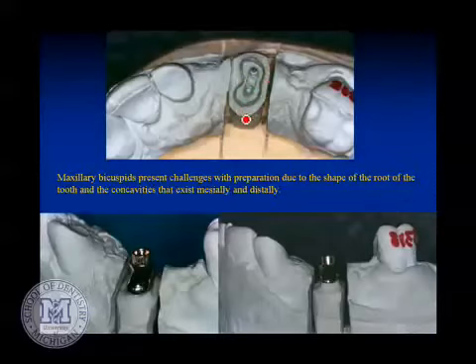If you're doing a crown or a fixed partial denture retainer on a maxillary bicuspid, be really aware of what the shape of a maxillary bicuspid is down near the CEJ. Can you see what a really pronounced concavity is present on the mesial of that tooth? And there's also one on the distal of the tooth, okay? So let's say you're missing a maxillary first bicuspid, and you're going to do a 3-unit fixed partial denture because you think that sounds like a really great treatment, and we do it all the time. The thing to be aware of is if you've got any kind of periodontal involvement at all, so there's a little bone loss around that tooth, the preparation on your second bicuspid is going to look like that on the mesial. So this is just for a post and coping.